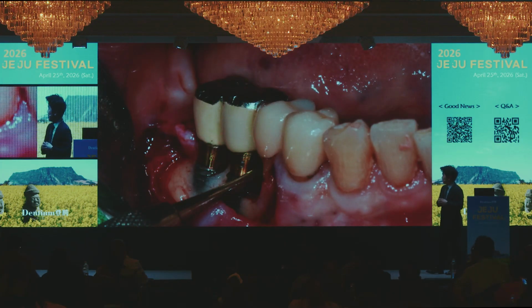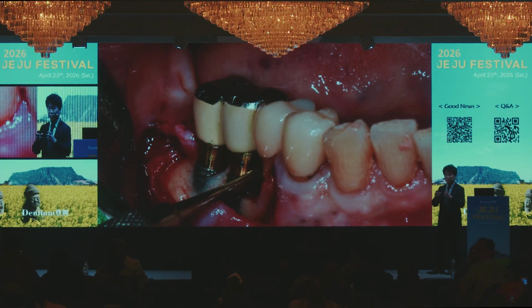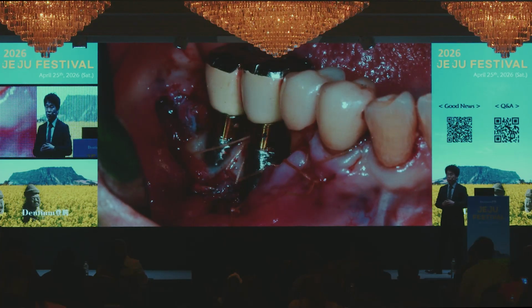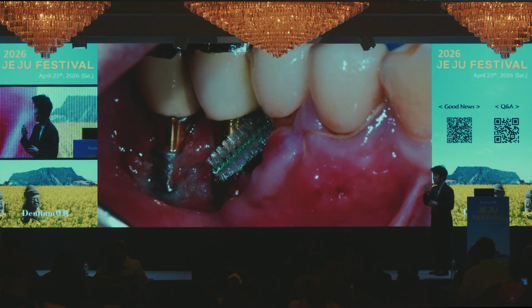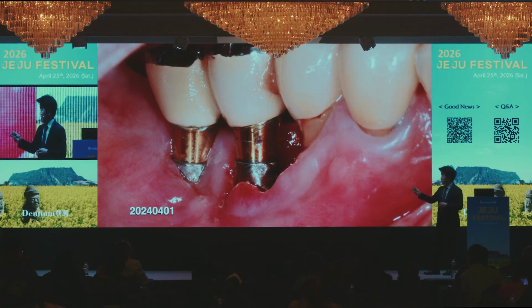Also the big torus does not allow access, so I polished this area. It healed by secondary intention, and then she could easily do brushing and interdental brushing, as part of the healing, as you can see.